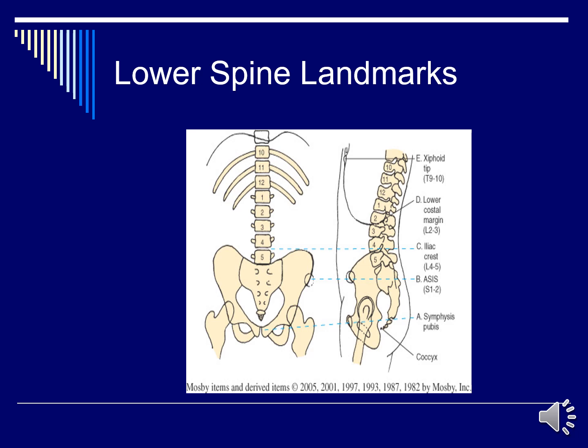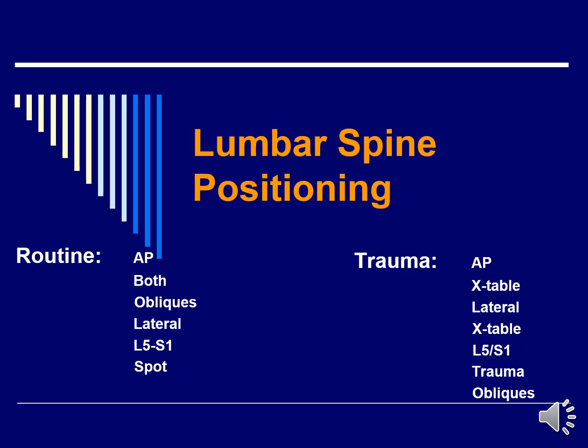Make sure that you're aware of your lower spine landmarks, as we will be using these as we're palpating our patient to put them in the correct position for the lumbar series. We'll now go into the lumbar spine positioning.